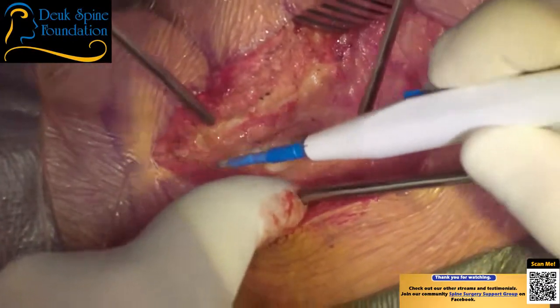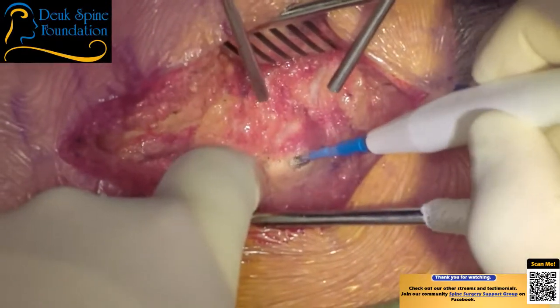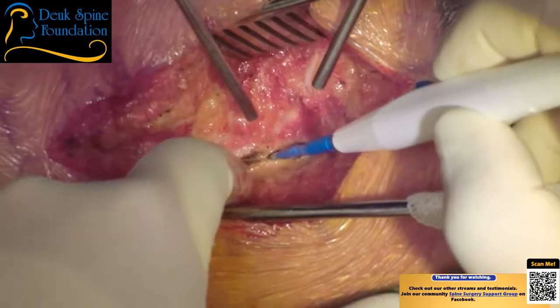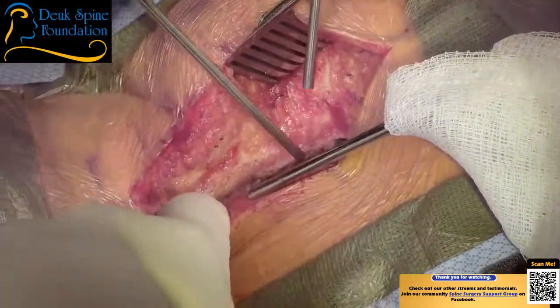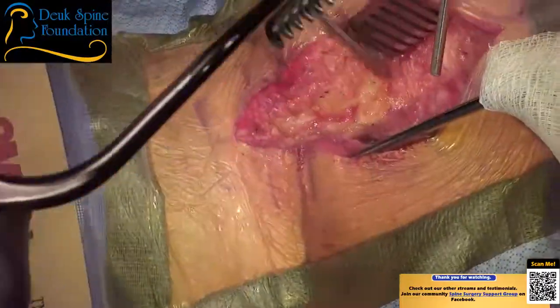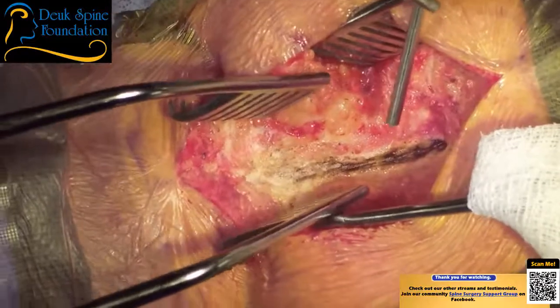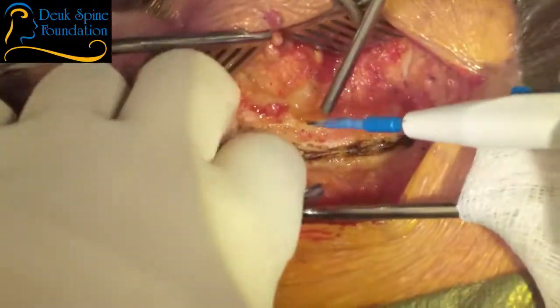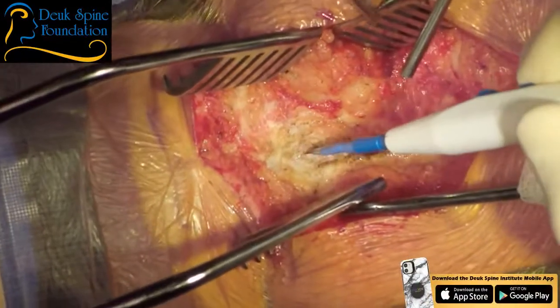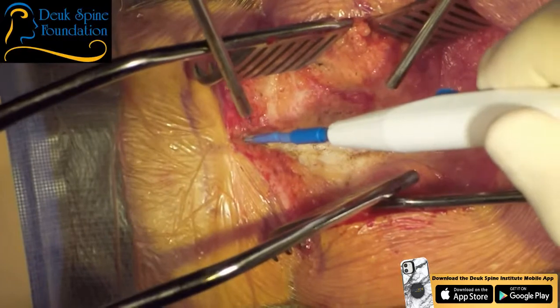or the intestine, in this case the spine, I can feel the tips of the spinous processes now. I believe I got C7 and T1. I don't know that for sure, and there's no way to know that until I find the T2 spinous process and until I find the T1 transverse process. But I can use those two landmarks instead of using x-rays to be sure of where I'm at, okay?